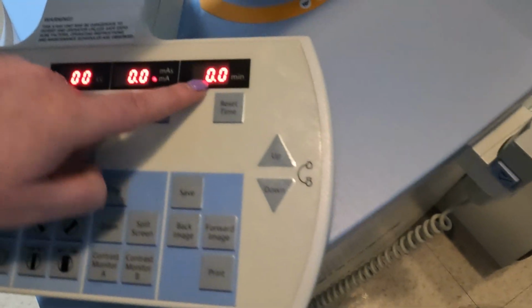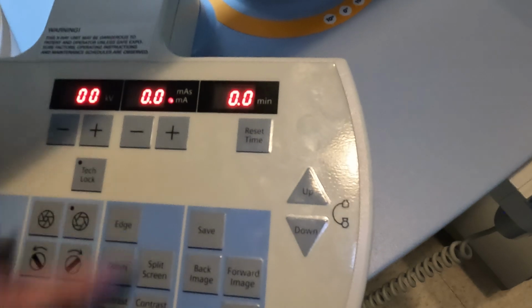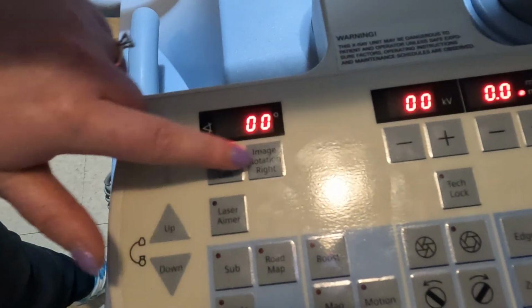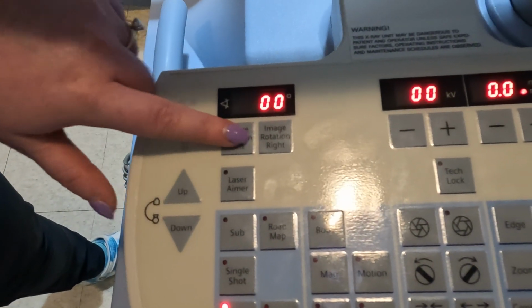And it has a 5-minute timer. So if after 5 minutes it starts to alarm, you just let your surgeon know and then you reset your timer. Also, there's image rotation up top here, so if you want to rotate your image that's on the screen, you can do it on the screen or you can do it here on the C-arm.